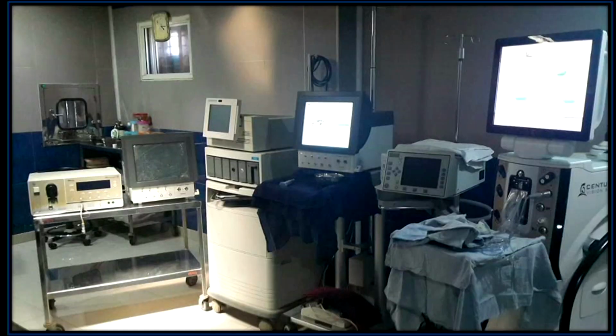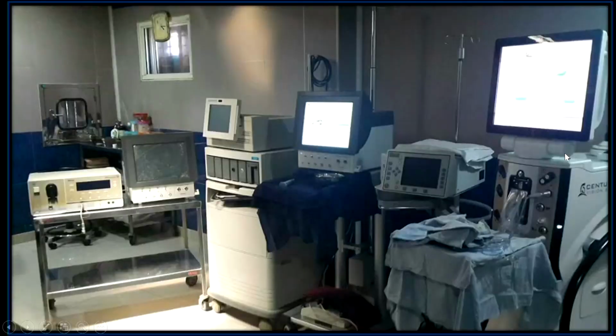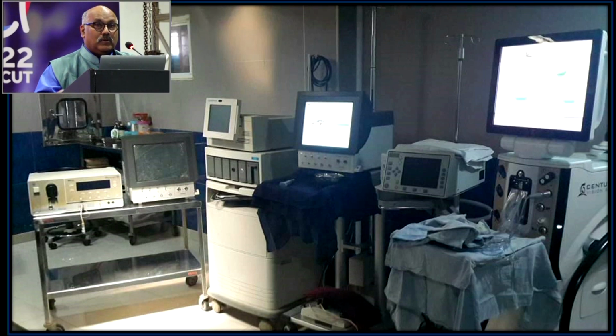Thanks a lot, Anup. Can I have the timer on so that I can keep a tab on my time? Timer, 10 minutes. So, friends, I have used all these machines that you see on the screen, and what I would like to start off by telling is, you need to understand your machine extremely well. Because each machine is different, and whatever parameters you use for a particular machine cannot be reproduced in another machine without knowing what that machine does.